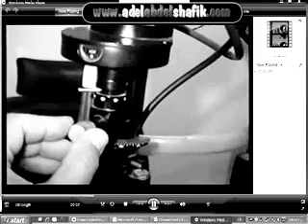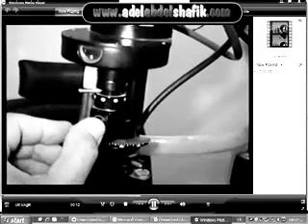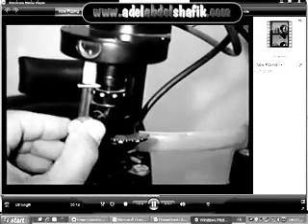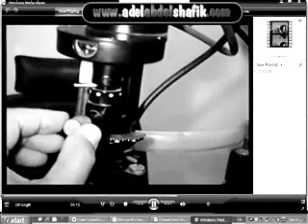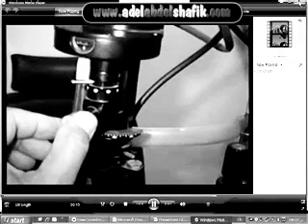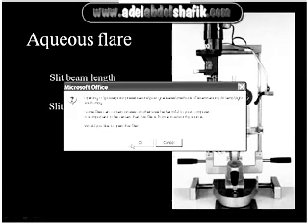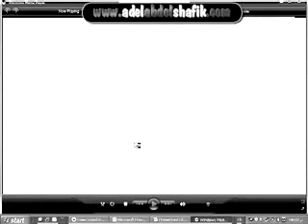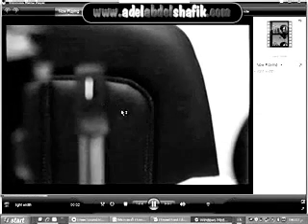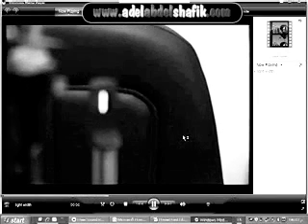Now for the posterior segment examination, we can use extra lenses to see the back surface of the eye, like the 3 mirror. In case of examining the macula, you can use another mirror on the slit lamp. This is the regular mirror we use for the anterior segment. You can see there is a long segment of mirror here. This is another mirror. You can replace the original one. The long part here is missing.